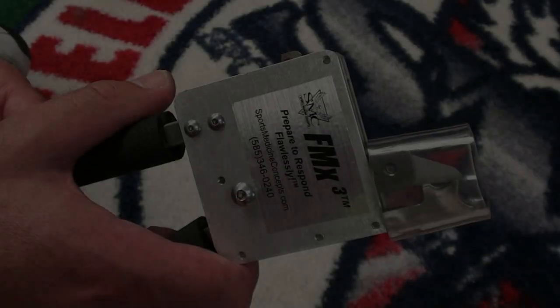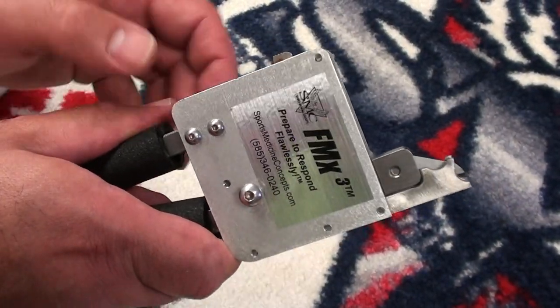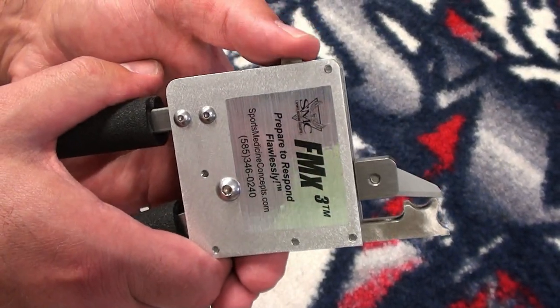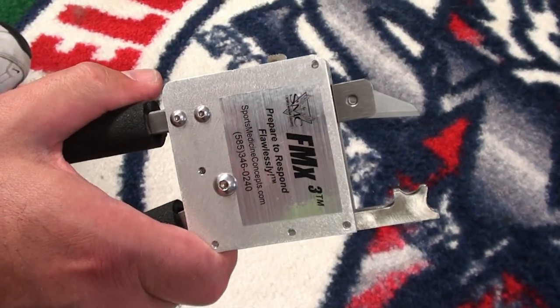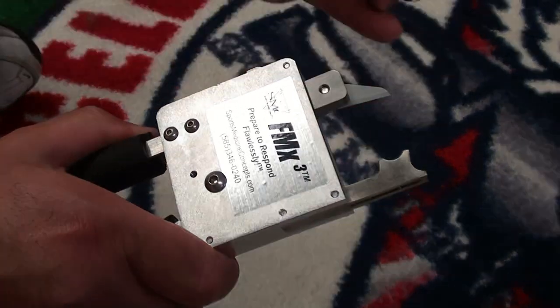In the event that attempts to remove the face mask fastener using a power screwdriver are unsuccessful, there are two techniques for cutting the Revolution Forehead Speed Loop Strap Fasteners using the FM Extractor. Begin by removing the protective safety blade cover from the FM Extractor. With the FM Extractor completely closed, choose either the two- or four-step ratcheting setting. Next, use the release lever to open the opposing ends of the FM Extractor and lubricate the blade with the FM Extractor lubrication wipe.